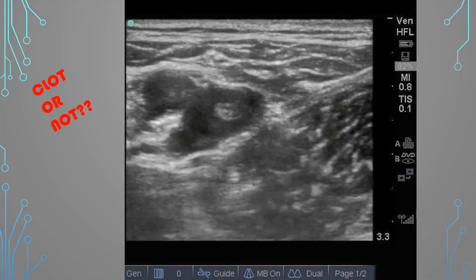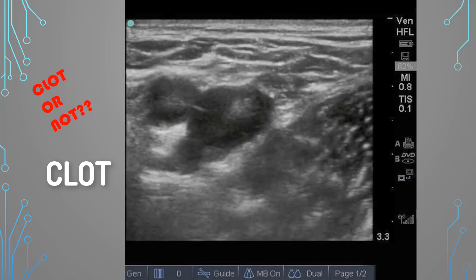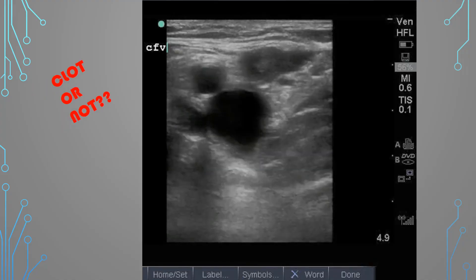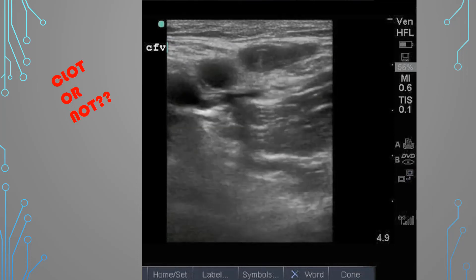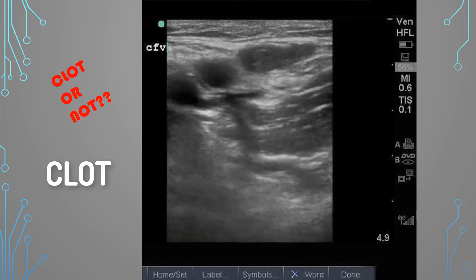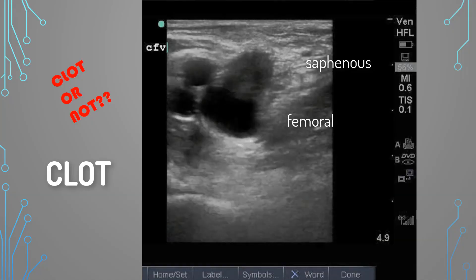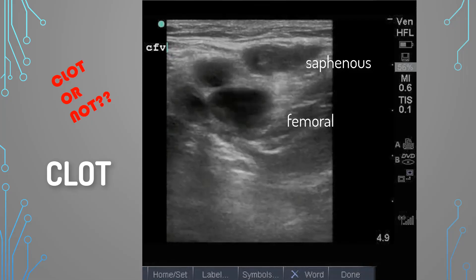What about this one? There is a clot — it looks like a little ping pong ball bouncing around in that vein, which is pretty concerning. Next case: it's a trick question. There is a clot, but technically it's in the greater saphenous, which is a superficial vein, not a deep vein. However, seeing that clot so close to the femoral vein is very concerning — it looks like it's just trying to drop into the femoral vein.